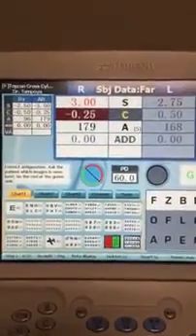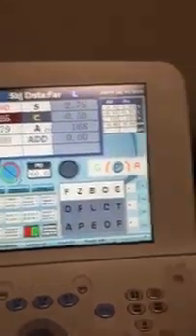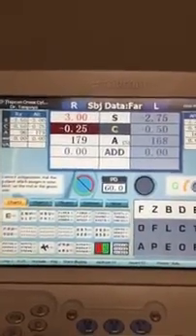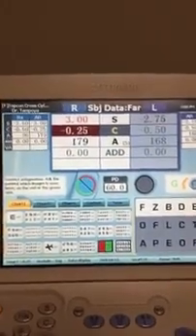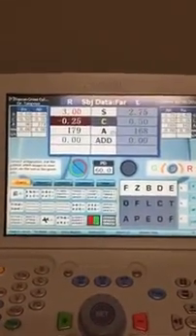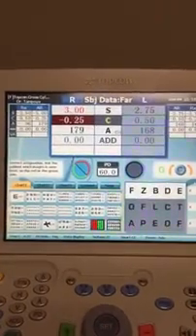Now, when the patient is looking through the Phoropter, they're going to see two lines, two FZBDE lines. And as you can see, this is the line highlighted right here. One's going to be on their upper left, which corresponds to the red, and they will see that red color around that line on that side, and the lower right will correspond to the green. So let's say the patient is looking through there with the right eye, and you say which side is more clear, the upper left with the red or the lower right with the green. And let's say they say the lower right with the green.